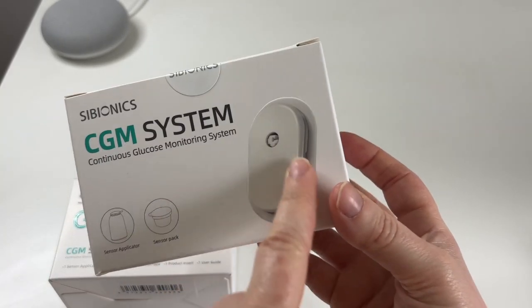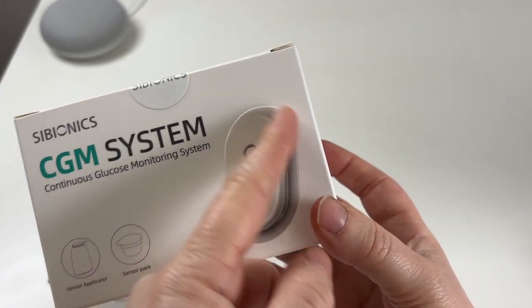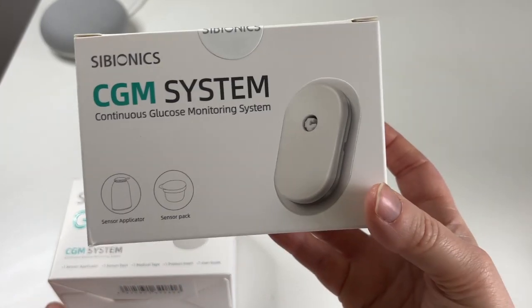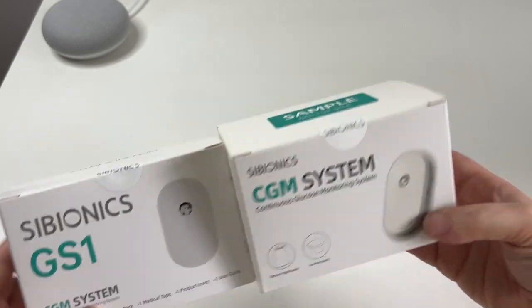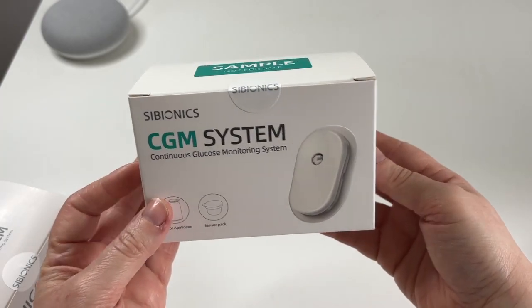This is the shape of the CGM, so you can see it's going to look different from Dexcom and Libre. It kind of reminds me of a Libre the way Libre has this little part in the middle — just like a longer version of the Libre. It's interesting that all of the CGMs have their own shapes. Let's get one of these open — we'll start with the sample pack.